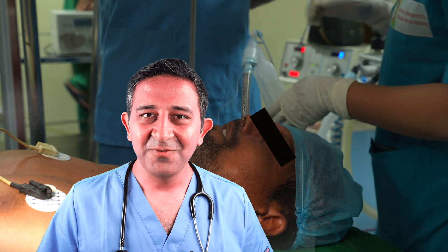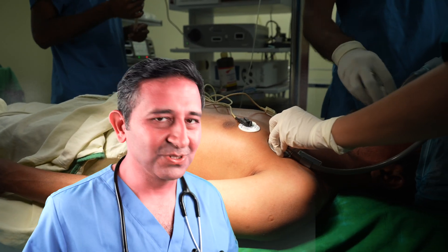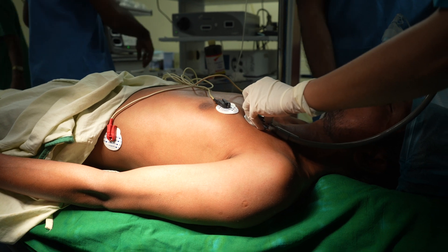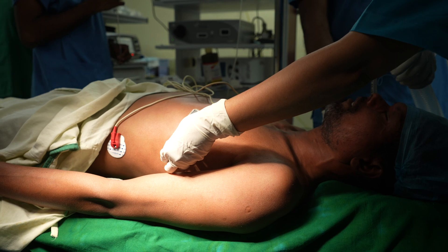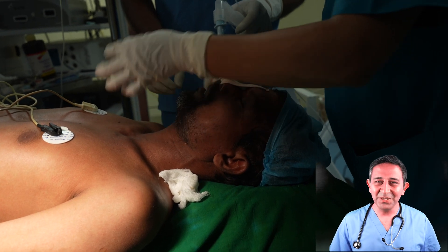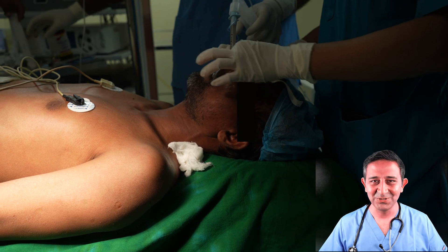There are a few different ways to check the correct placement of the breathing tube. In this case, they're using a stethoscope and listening to the lungs to make sure the breathing tube is actually in the right place. Here the breathing tube is secured in position with tape, and subsequently the surgery can be started very soon.